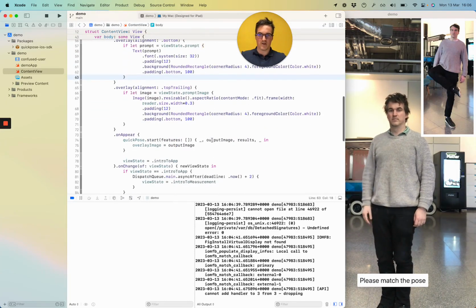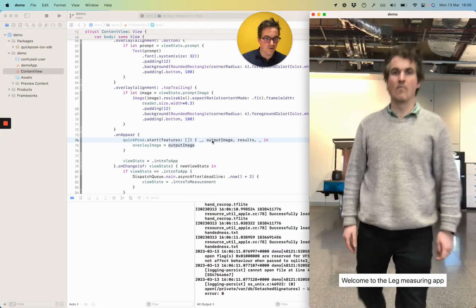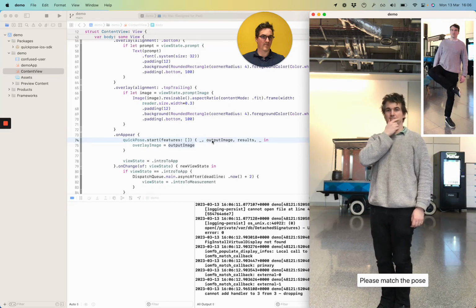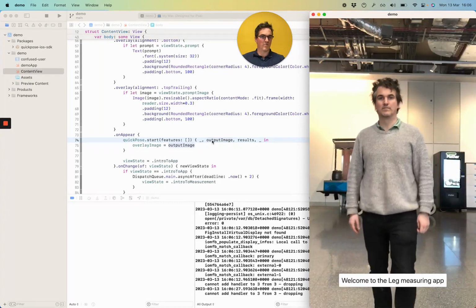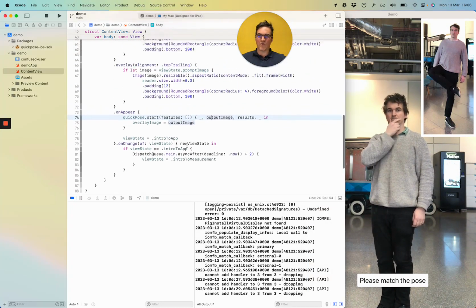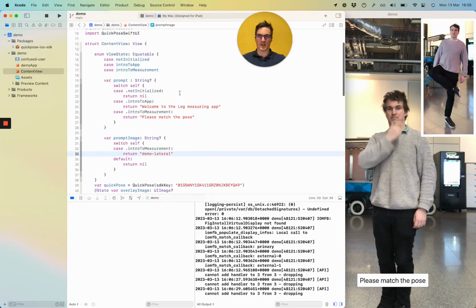Okay, so I'm going to rerun that, and I'm expecting on loop now for it to restart. So I'm coming in. Welcome to the leg measuring app. Perfect. Cool. Okay, so I think what would be good is if we actually take a measurement as well before going to the next level.